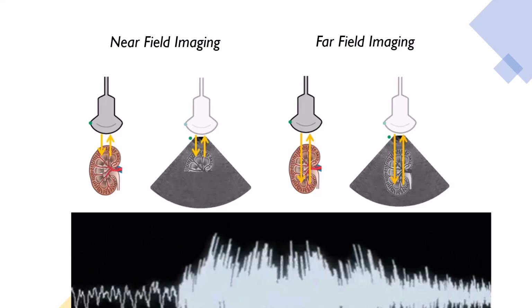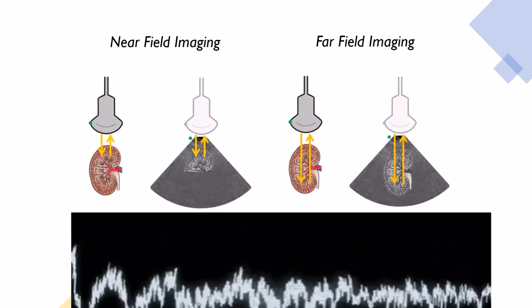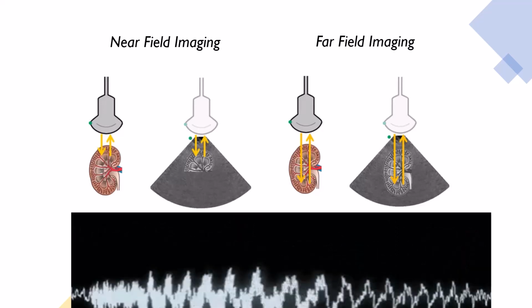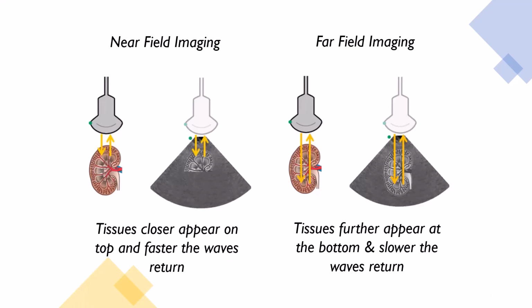The transducer generates sound waves in the ultrasonic range above 18 kilohertz by turning electrical energy into sound. Upon receiving these sound echoes, the transducer turns the sound waves back into electrical energy, which can be measured and displayed.